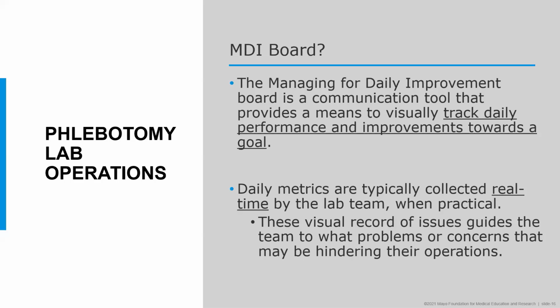It's visual management, and in continuous improvement we emphasize visual management a lot, because if you can see it, everybody can see it. So it also goes as part of the transparency. We want to make sure that everybody understands the issues in the lab. We want everybody to have the same understanding of the issue, and then we're all working to have a solution to that.